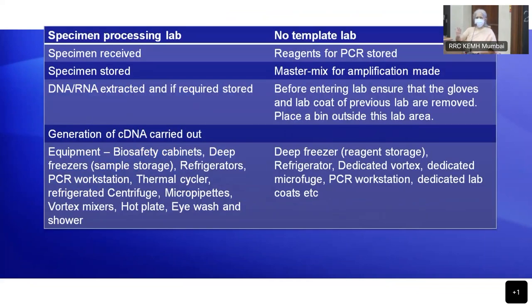So this is basically the specimen processing lab, and there is a no template lab. What is a template? Anybody, what is a template? The nucleic acid that we have extracted from the sample becomes the template. I will leave this slide as a little problem slide and take a long time to explain. But the basic thing is there should be two different sets of designated equipment, manpower, consumables, reagents, etc.